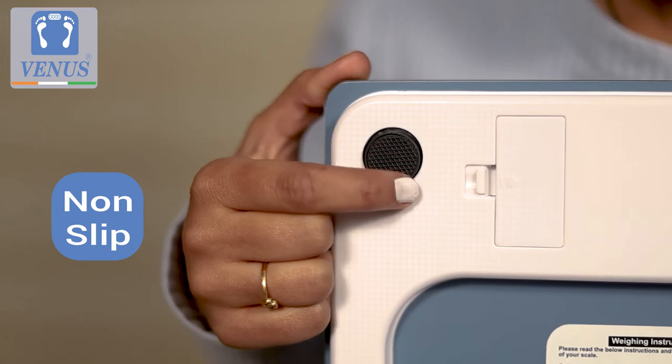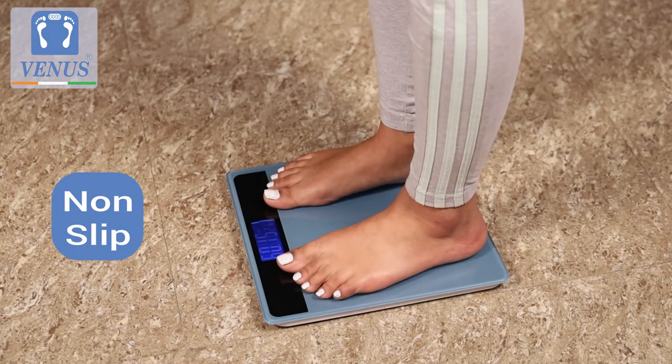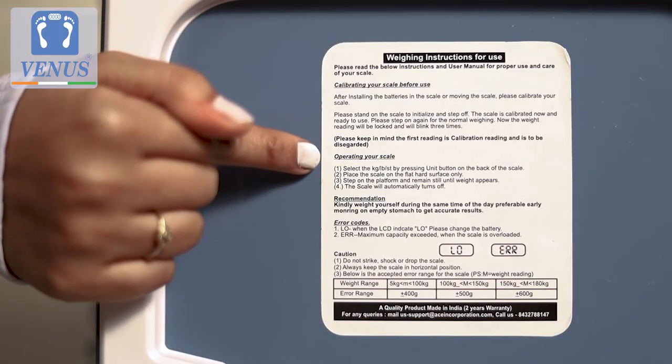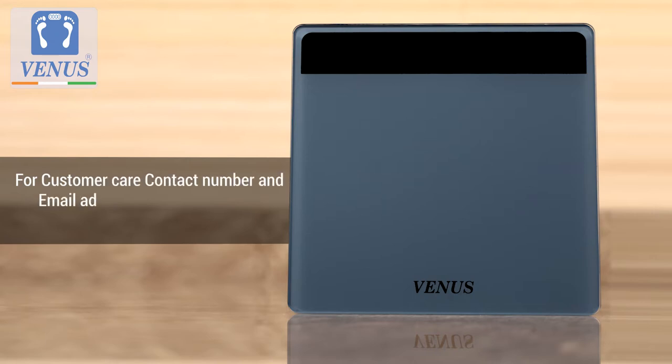The non-slip feet of the scale ensure safety on any flat hard surface. The full instructions to use are displayed on the label at the back of the scale, with a customer care number and email ID to report any issues.